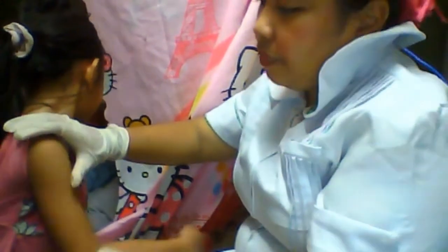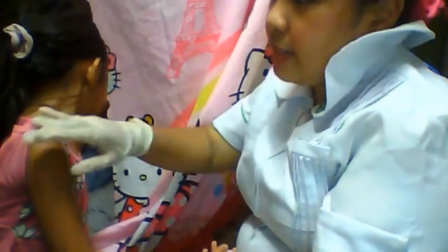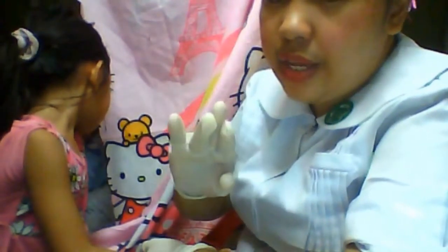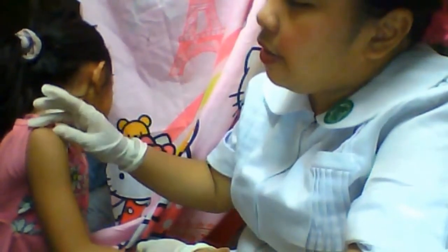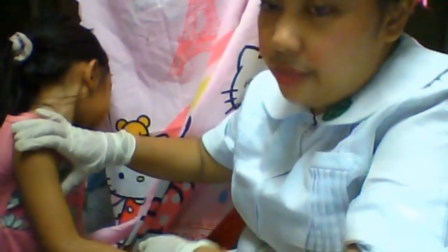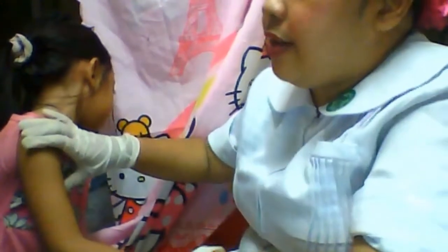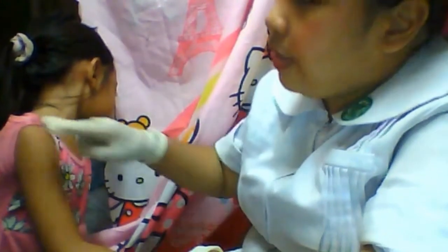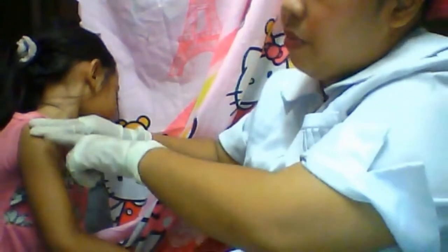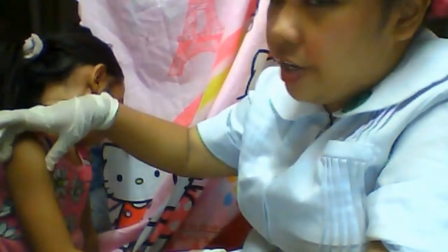So here, 3 finger breadths, assuming that this is an adult patient. For an adult patient, that is 3 finger breadths from the acromion process, but the bony prominence is here. So 3 finger breadths like that. This one is our target. For a child, 2 finger breadths from the bony prominence, and this will be our target. So 2 finger breadths only for a child, because they have a shorter and smaller deltoid area.